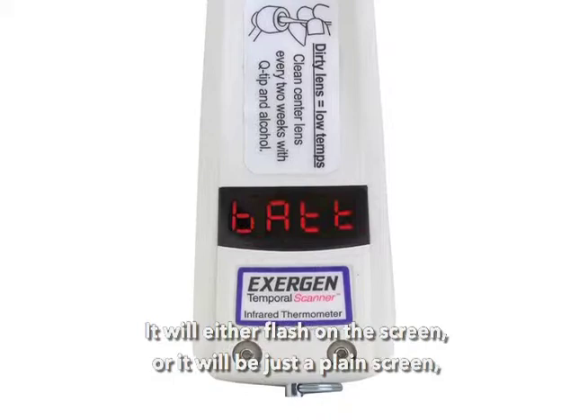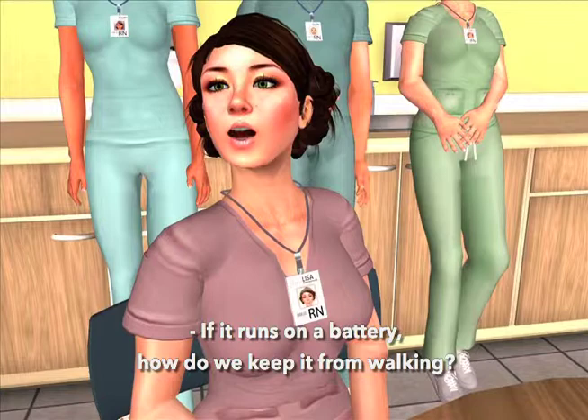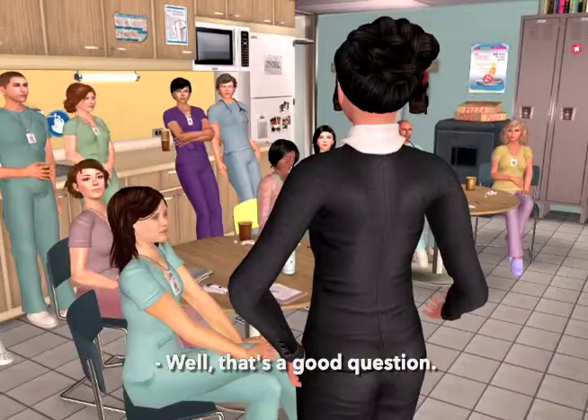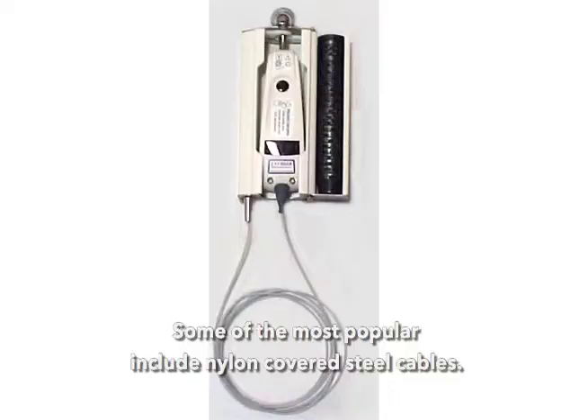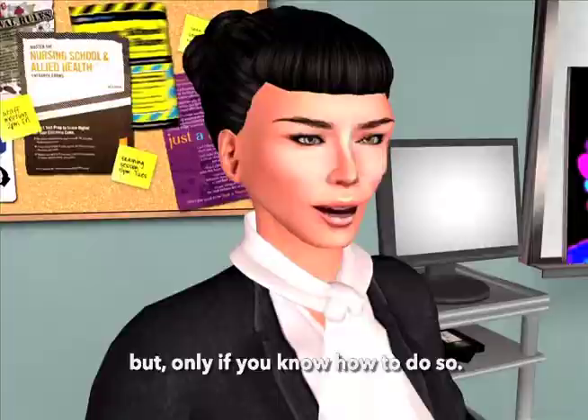If it runs on a battery, how do we keep it from walking? We have many anti-theft solutions shown on our website at exogen.com. Some of the most popular include nylon-covered steel cables that can't be cut easily, a system that requires a return to base after a specific number of temps, keyless locking wall mounts, and cables that can be conveniently removed — but only if you know how to do so.